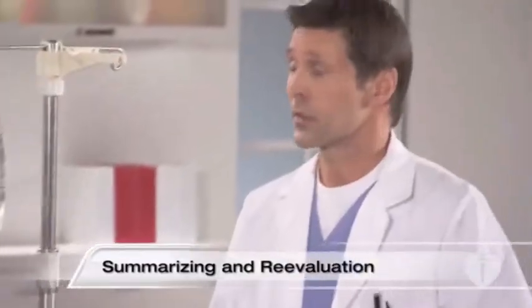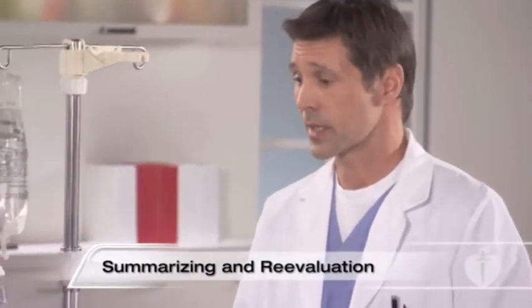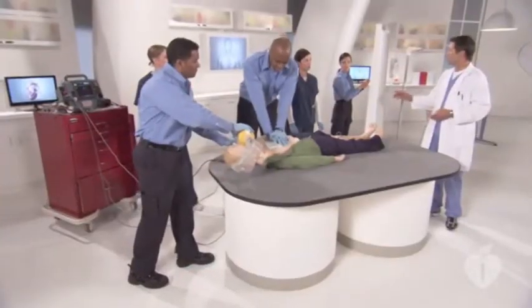Great. We've given 2 shocks and given 1 milligram of epinephrine. The next medication to consider is amiodarone. Dana, please prepare 300 milligrams of amiodarone. Drawing 300 milligrams of amiodarone.